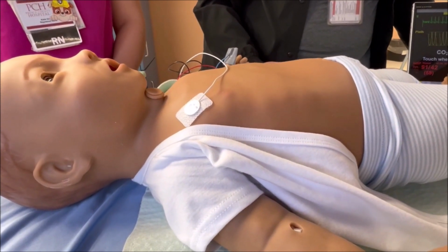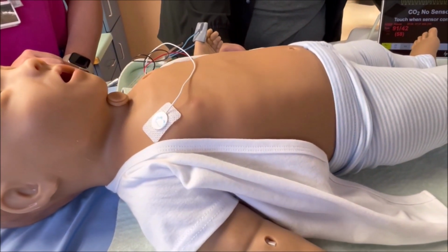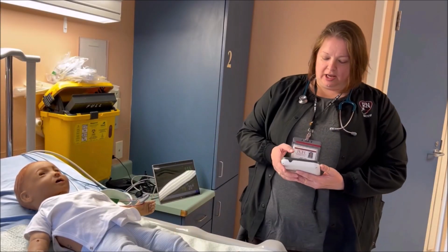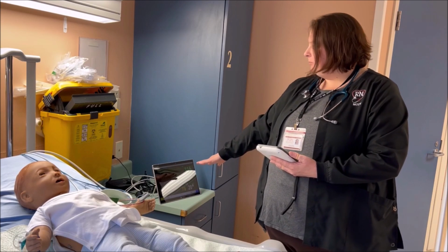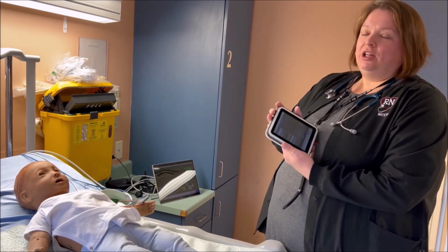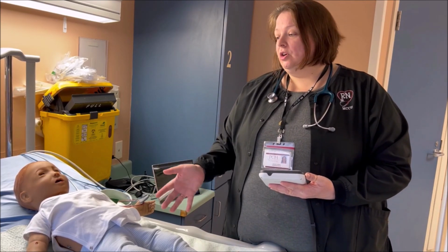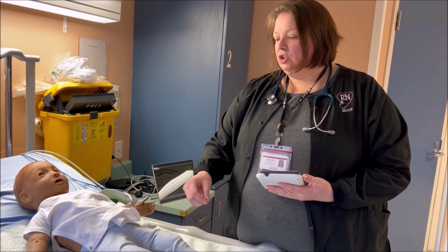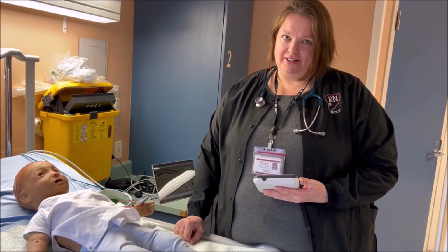We can simulate capillary refill, which has to do with how well they're perfusing the rest of their body or how their tissues are being oxygenated. They have real vital signs, and so when we hook them up, it's actually wirelessly to this monitor, we're able to get information as well. If I want to change something, I use this little iPad so that I can change the scenario as the students or the learners are assessing the child. So they have real life assessments that are related to what is going on in the scenario, and they actually have to figure out not only what's happening, but how they're going to fix it.